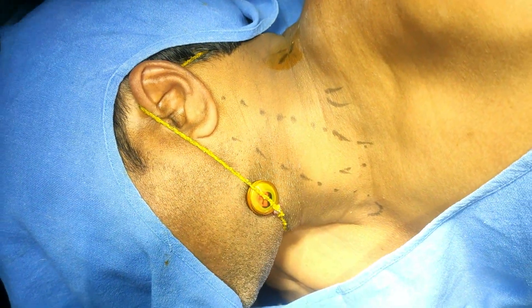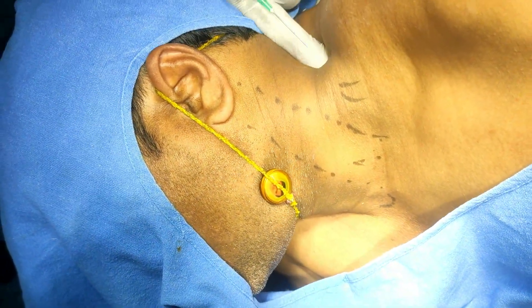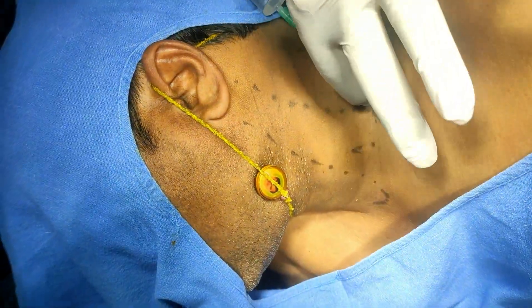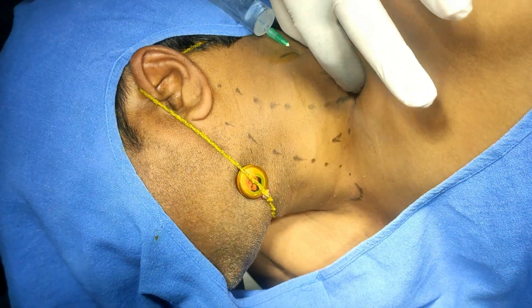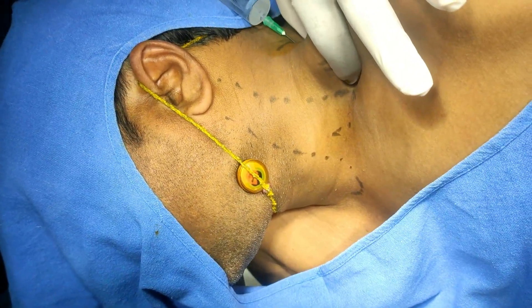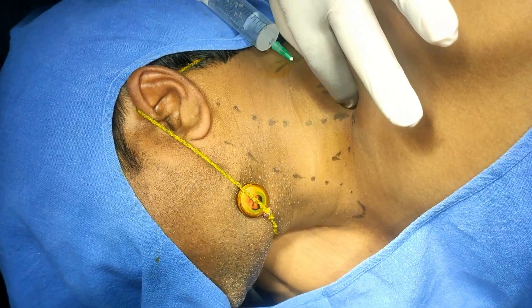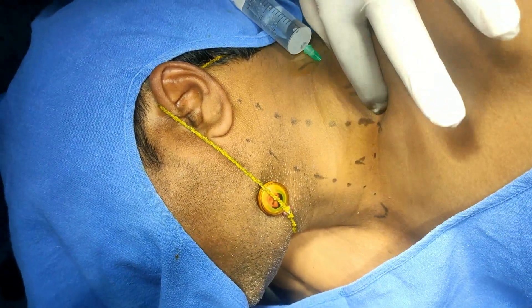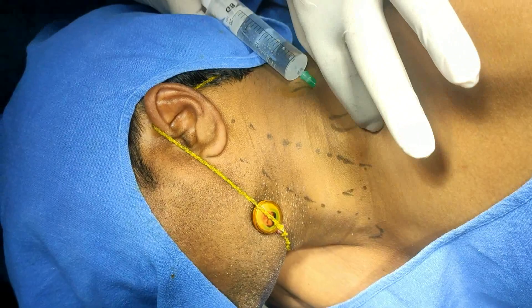Here I am going to insert the needle from this point. Inserting the needle — lift the levator scapulae like this and insert the needle towards the direction of the inter-scalene cleft. Aspirate and then inject. It is deep to the muscles.